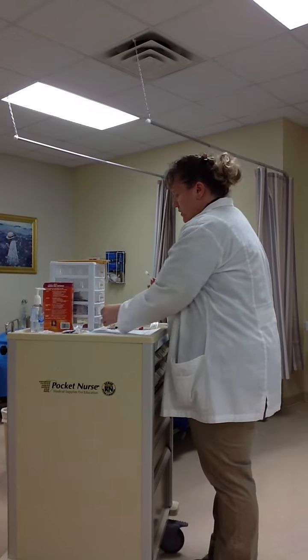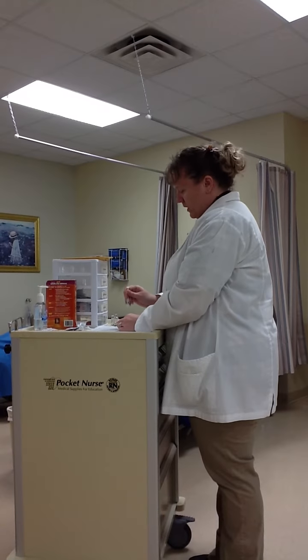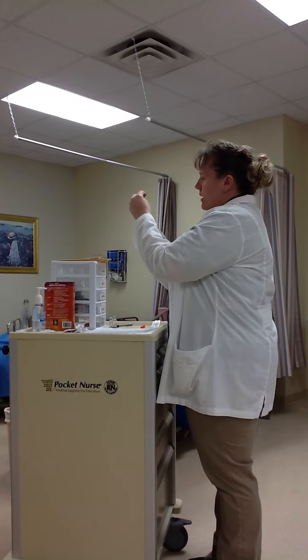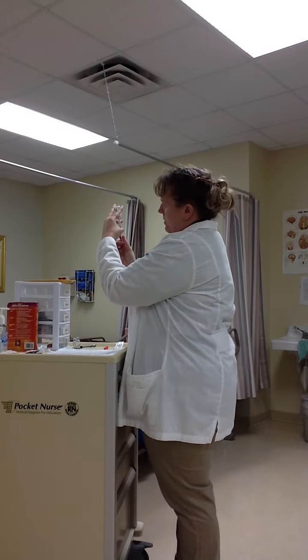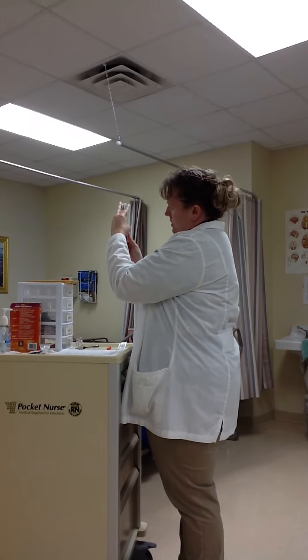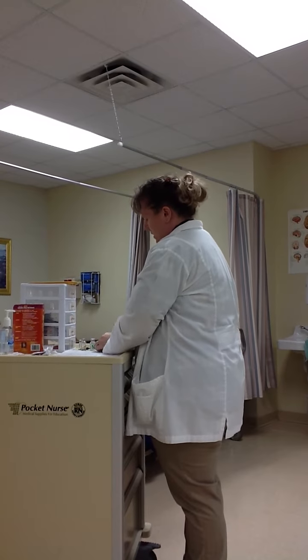I now know that I have to have a total of 28 units, so I'm going to go back, make sure that my insulin is mixed well, put that back into my vial, tip it up and pull out to 28, because that is the total units that I want. I have 28 units showing. I'm going to show that to my instructor. I'm going to set it back down, pull that needle out.